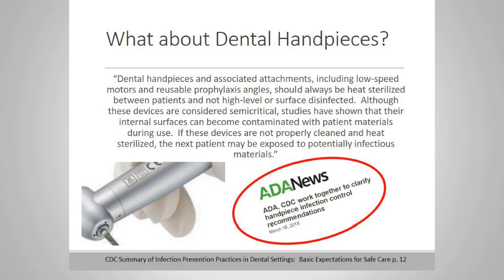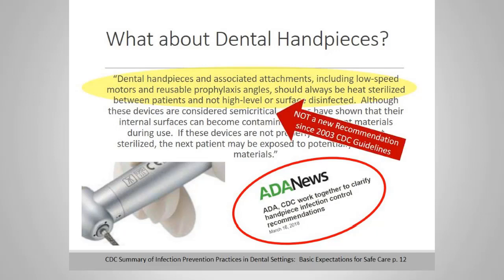If these devices are not properly cleaned and heat sterilized, the next patient may be exposed to potentially infectious materials. Now, CDC wrote this in the CDC summary, and it caused lots of controversy, but what I want to share with you is that this is not a new recommendation since the 2003 guidelines. The American Dental Association came out with a statement on its website in March of this year, saying that the ADA and CDC are working together to clarify handpiece infection control recommendations.